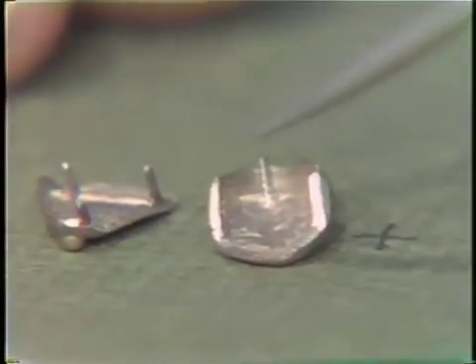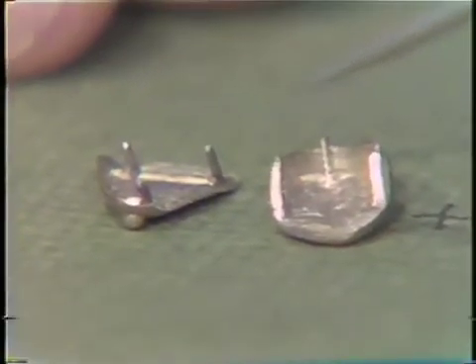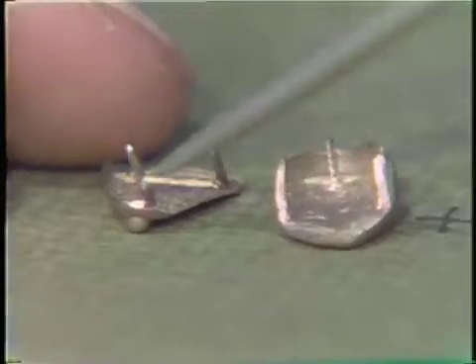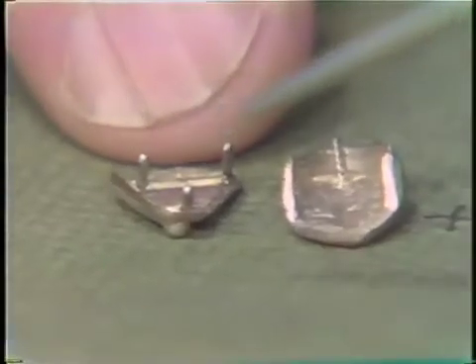Should there be a bubble in this spot, a chisel or a small round burr can be used to remove the bubble, but care must be taken not to thin or weaken the pin.